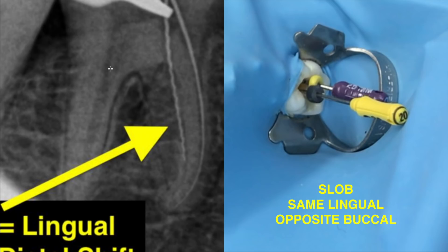So now we've taken our radiograph, and right away you can zone in on this Hedstrom file, which looks totally different than our regular K-file. And the SLOB rule still applies — absolutely. This is one simple way to learn the SLOB rule.